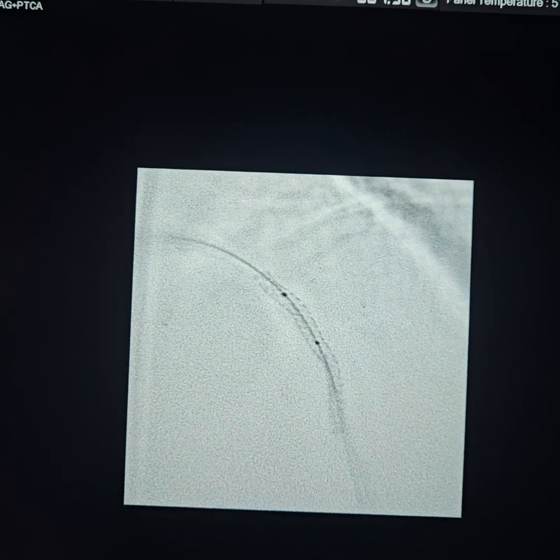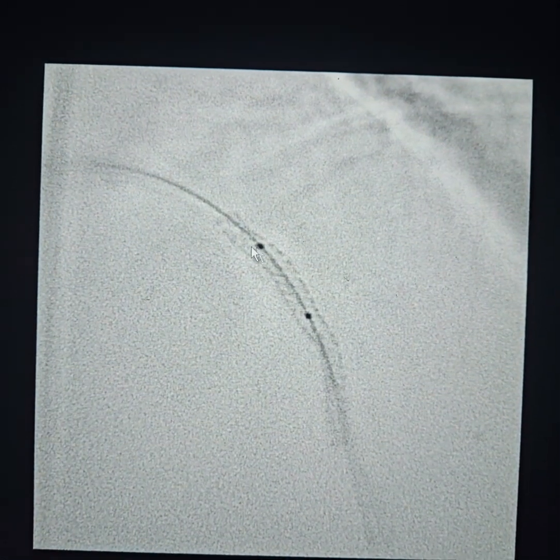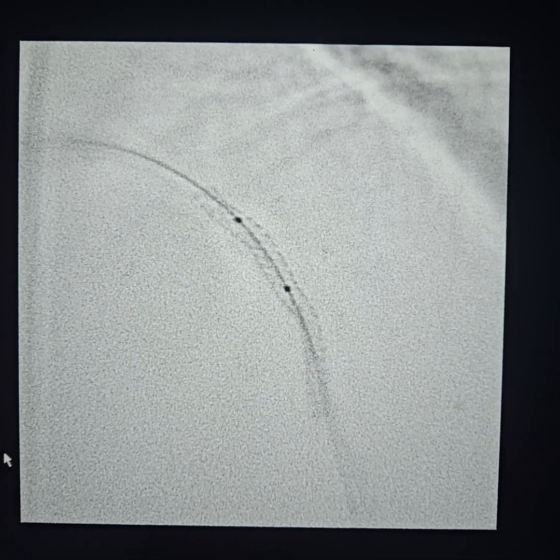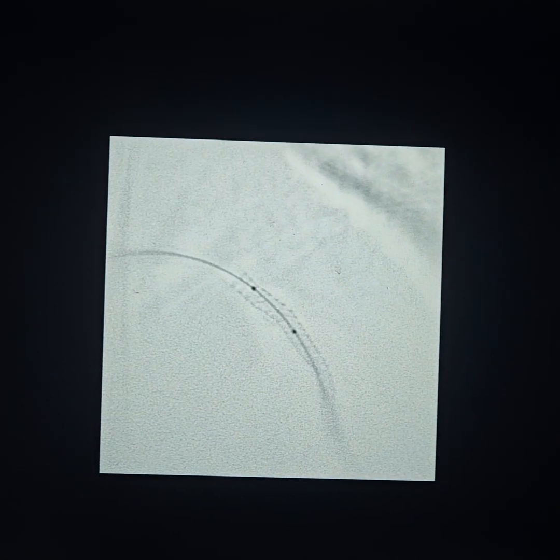During post-dilatation, we are seeing that the proximal end has not opened up as much, so we will be attempting more post-dilatation with the 3.5 mm NC balloon. After further dilatation, the proximal end of the stent has opened up quite nicely and we are satisfied with the result.